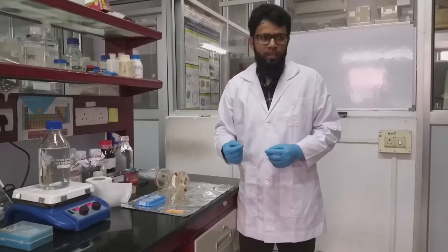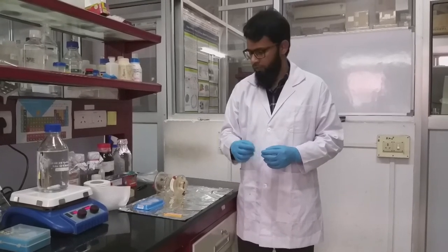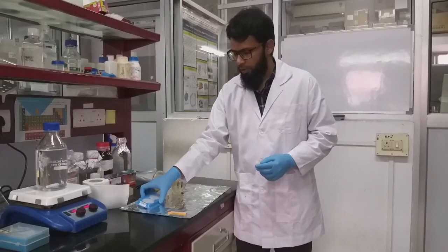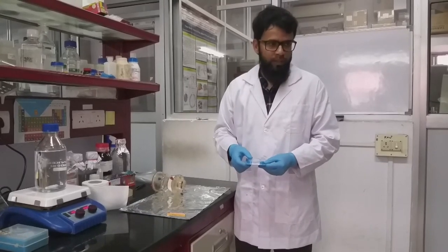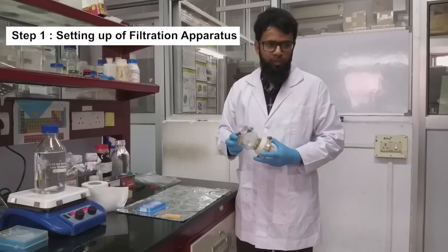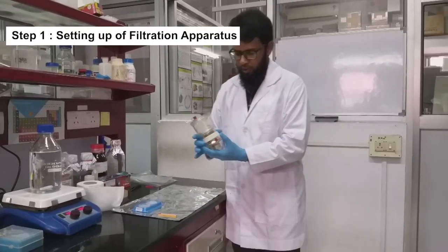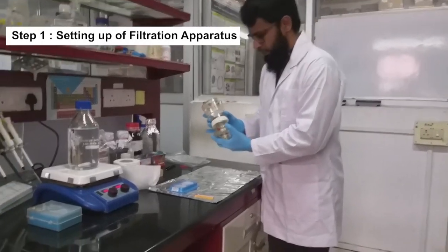We cannot autoclave this media because it might degrade the components of the media. For that purpose, we use 0.22 micron filters. This is a 250 ml bottle top filter. Now I will be demonstrating how to prepare filters for media.